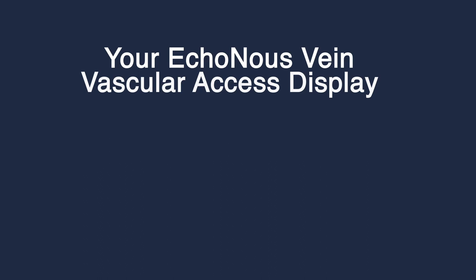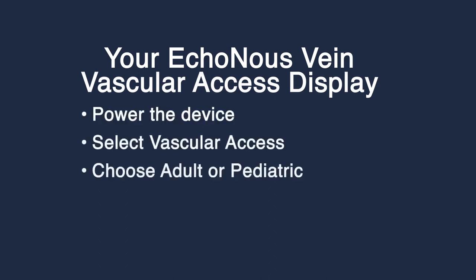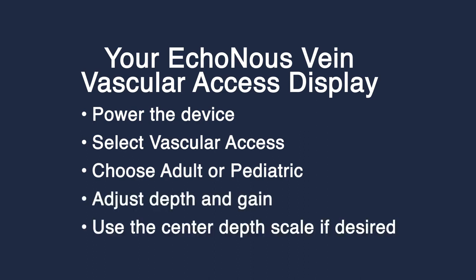To recap: power on the device, select Vascular Access, and choose Adult or Pediatric. Adjust the depth and gain as needed, and use the center depth scale if desired. Happy scanning!